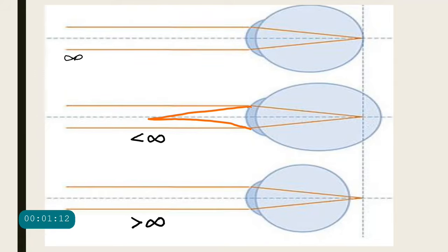As we know, in a normal eye which does not have any refractive error, the far point is infinity, and the conjugate point for this far point will also be infinity. So if the fovea acts as an object, the image will be formed at infinity, and as we know, the rays coming from infinity are mostly parallel, and therefore the rays will look parallel in their vergence.